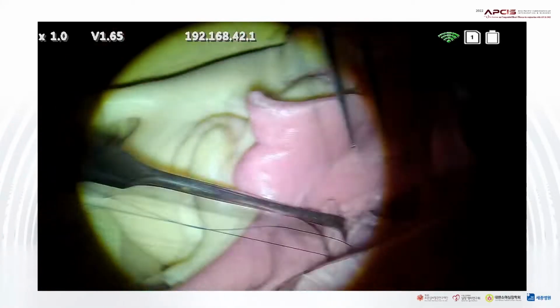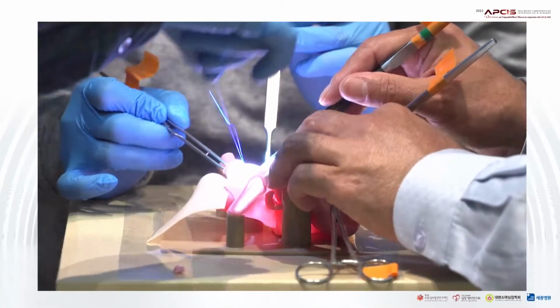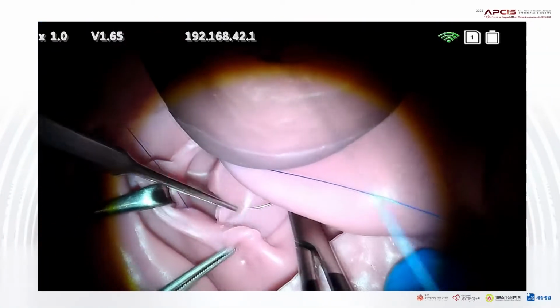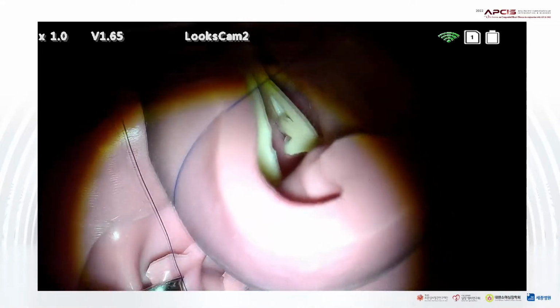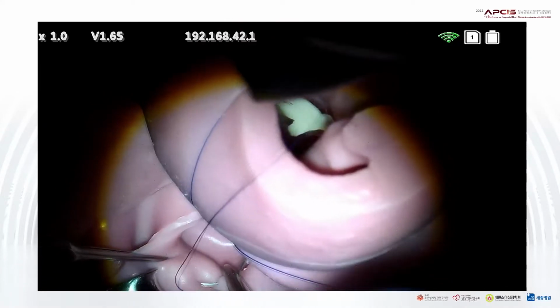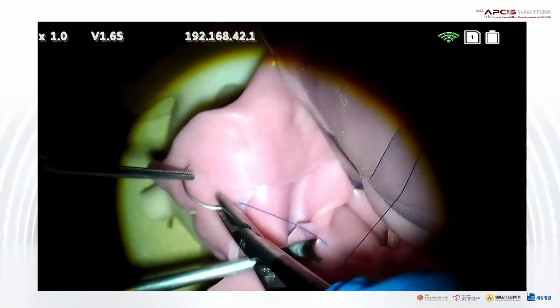Now we are making the posterior wall for the systemic venous blood pathway. Now surgeons are doing the Senning procedure. That is what we call the first layer formation. That means the isolation of the pulmonary vein. Right? Thank you for your explanation.